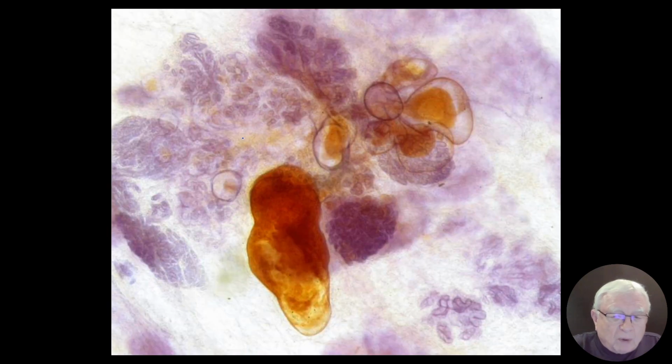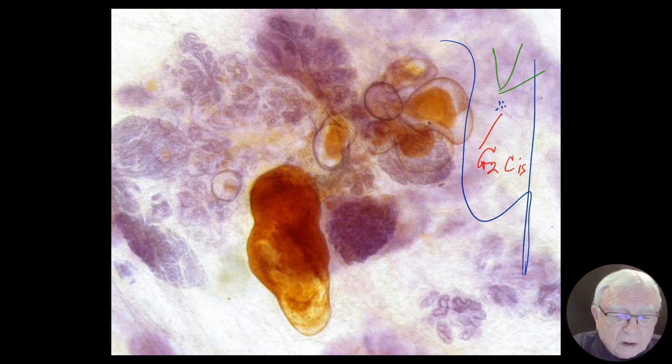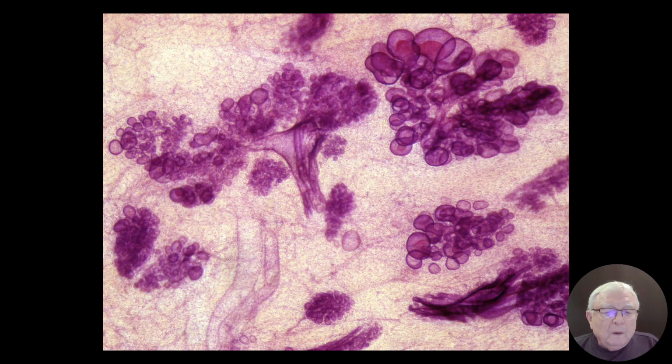Dear colleagues, this is a problem for the radiologist. Here is the mammogram. One cluster, discernible calcifications. And then, of course, the anxiety level goes up because it could be grade 2 cancer in situ with necrosis, but it could be fibrocystic change, papilloma, and fibroadenoma, right? Which one is that? In this case, this is fibrocystic change.